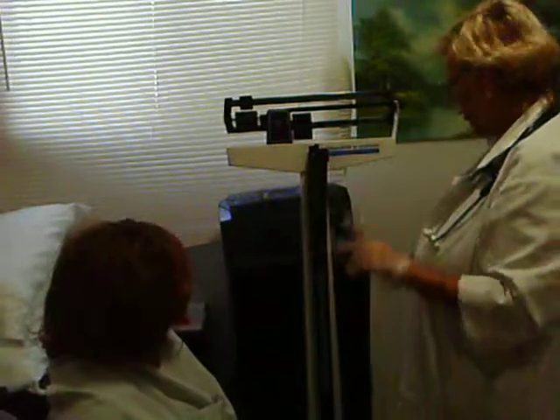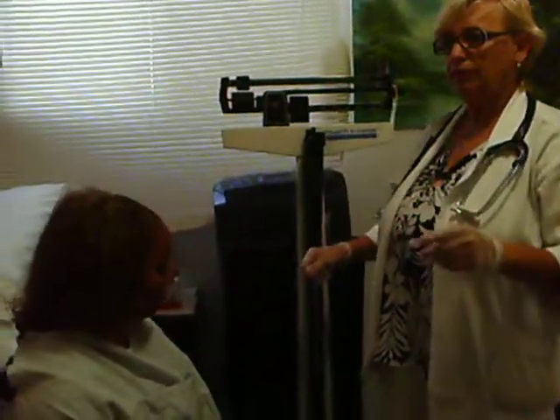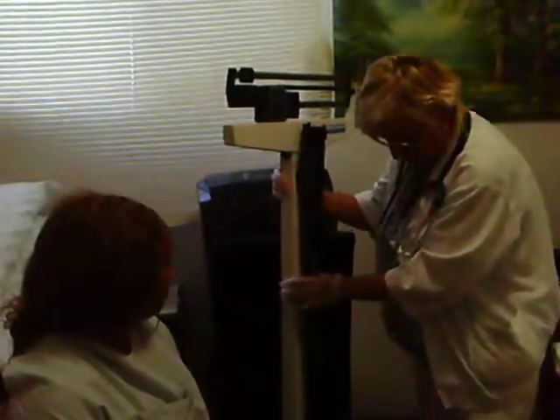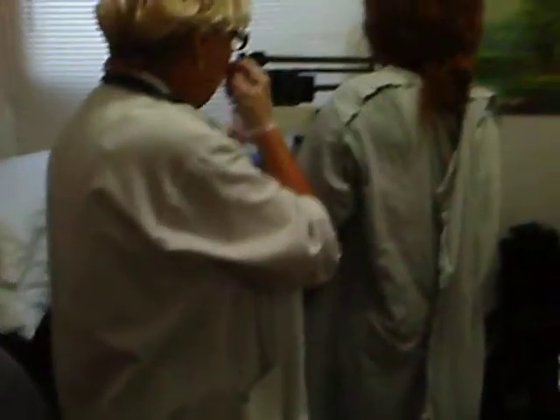I need two paper towels, which I forgot to bring. One I put on the floor, and the other one I put on the stairs of the scale. Paper towels on the stairs — this is green. Would you please stand up for me and step on the scale from that side? Turn and face the scale. Be sure not to touch me or the scale.